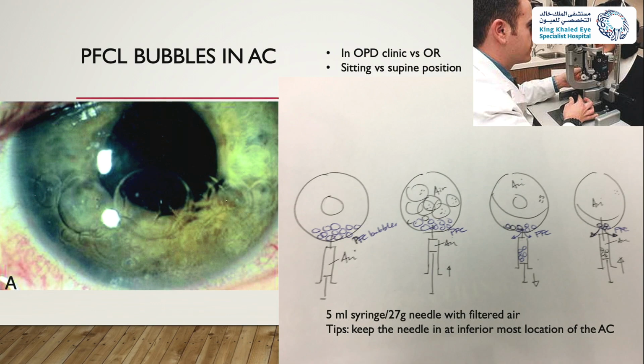Yes. Yeah, it's because we are now moving to small gauge vitrectomy, you have a higher jet flow, and that disturbs the PFCL bubbles, and that causes dispersion and multiple bubbles. In the old days, when probably many of you haven't, except the senior doctors, you did 20 gauge. In 20 gauge, the flow is not as high as the 27 to 25 gauge flow, and there's less dispersion.